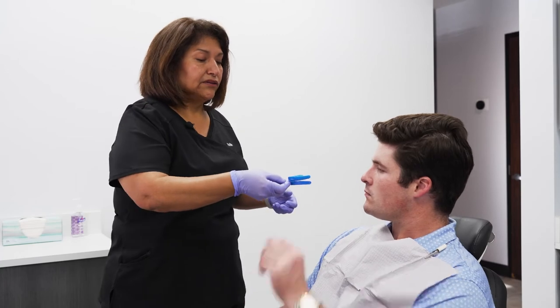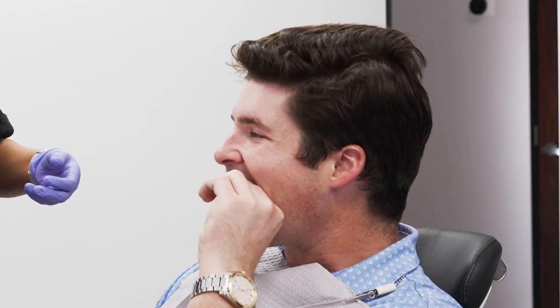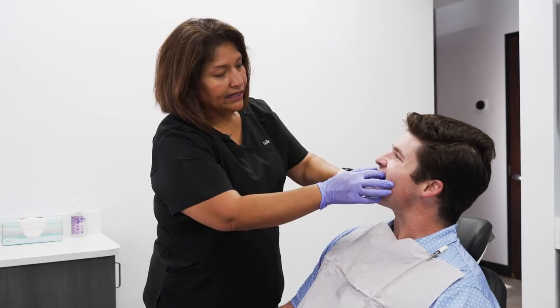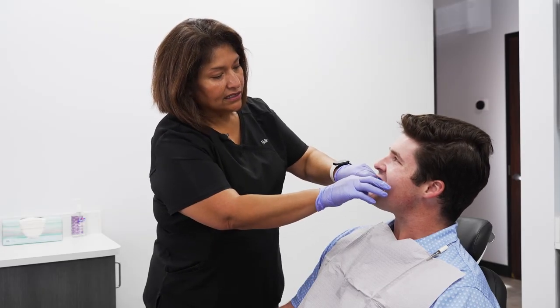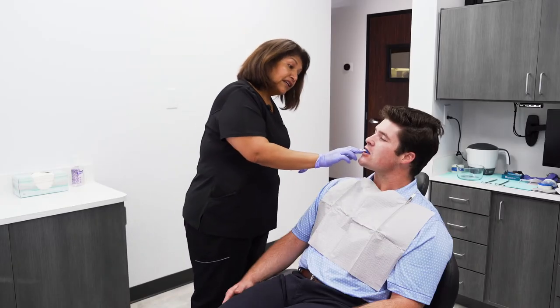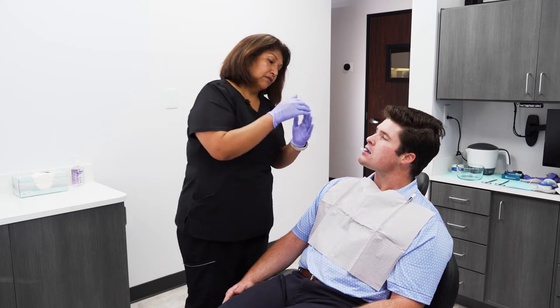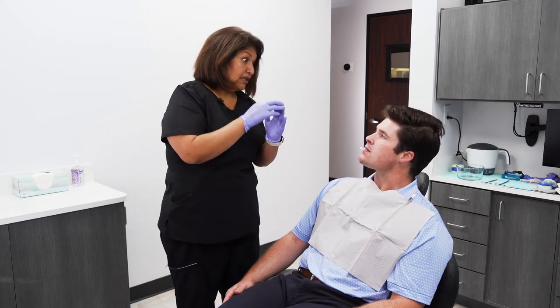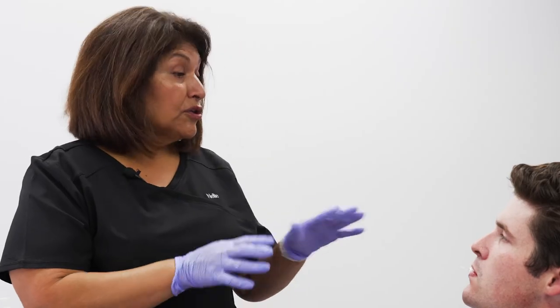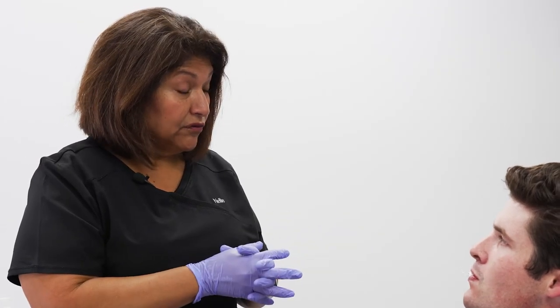Okay, go ahead and do that for me, please. Good, and then bite. Everything looks nice and moving and comfortable. Now, in this setting here, your lower jaw is aligned up to the upper teeth. Does that feel uncomfortable at all to your jaw? No. Okay, so we want you to start in a position that is comfortable.